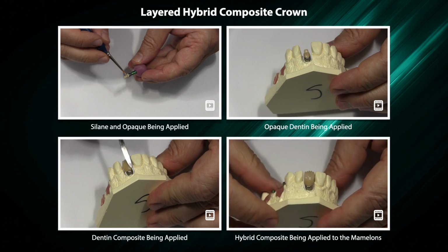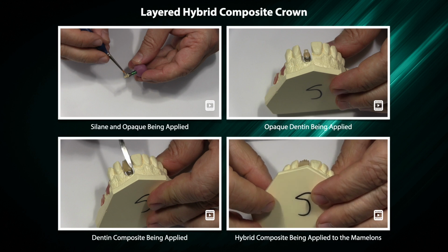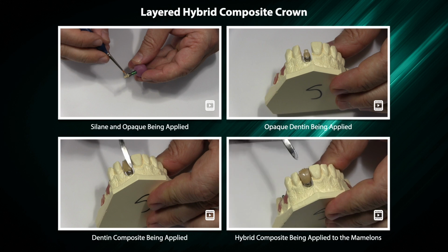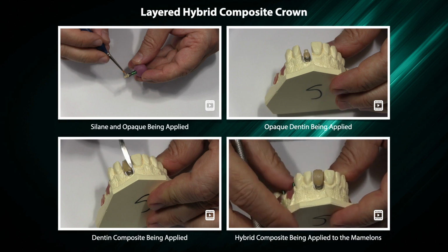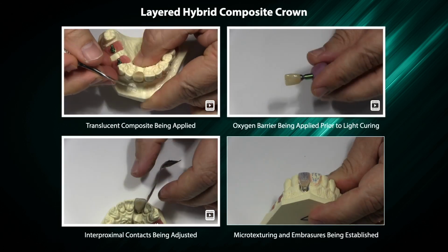Hybrid composite being applied to the mamelon. Translucent composite being applied.